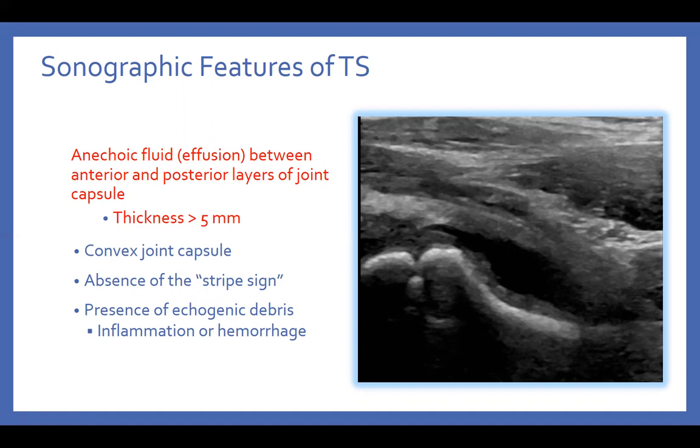Also, your mission is to look inside and evaluate this effusion. Do we see debris in it? Could be blood, could be pus, could be anything, debris, whatever it is. We need to ensure that it's put on the report, because that's highly important. I'm not saying septic hips always have debris in the effusion.